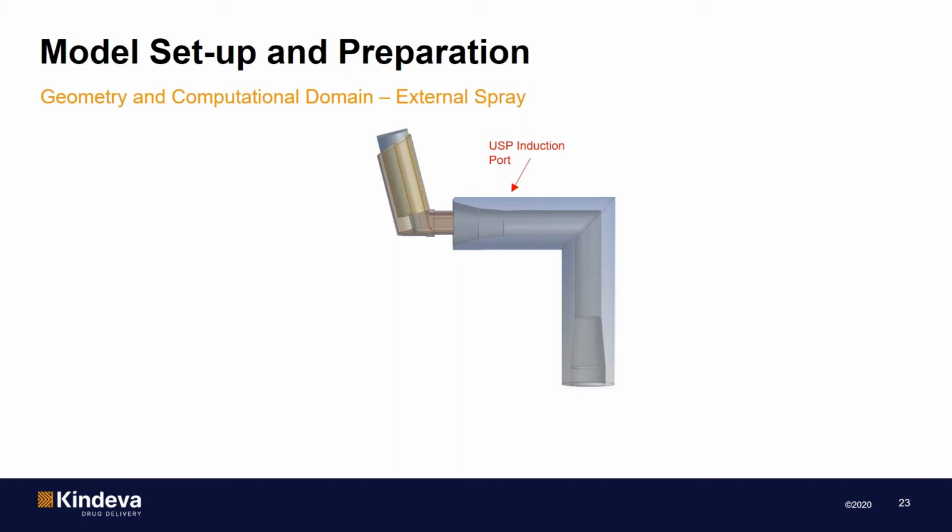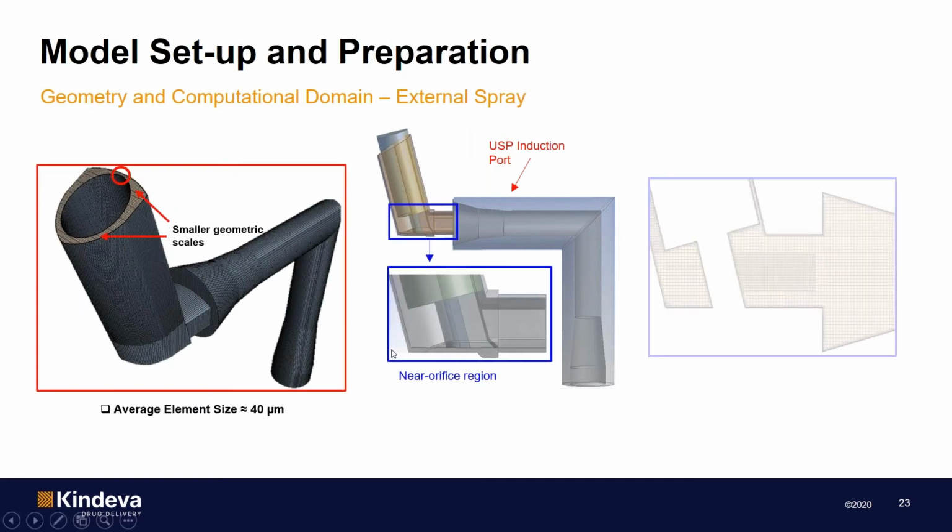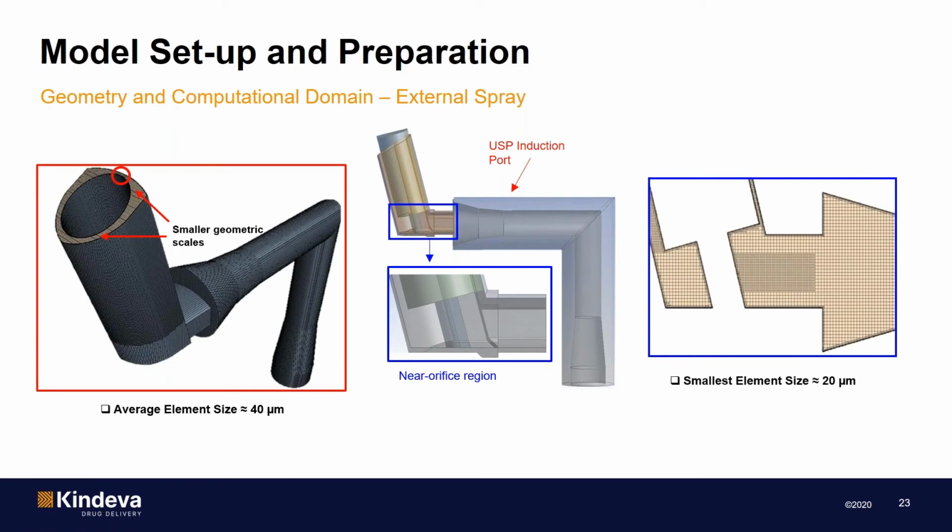Now, the other part of the simulation is basically the external spray modeling, which we also seek to predict the spray characteristics issued outside of the pMDI. Now, the CFD domain for this part of the modeling is basically a typical pMDI that is injected into the USP induction port. And again, in this simulation, the walls are assumed to be smooth and adiabatic. The mesh regions with the smaller geometric scales, as well as the near orifice region of the pMDI, are also refined to be able to capture more accurately the flow solution quantities. And we discretize the entire domain into approximately 1,500,000 hexahedral elements.